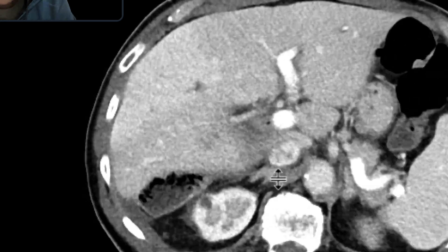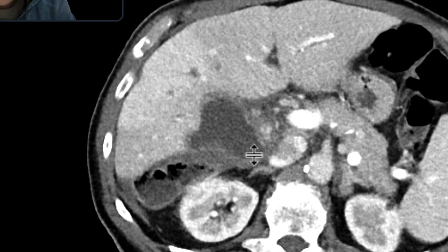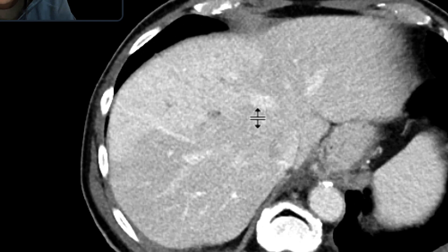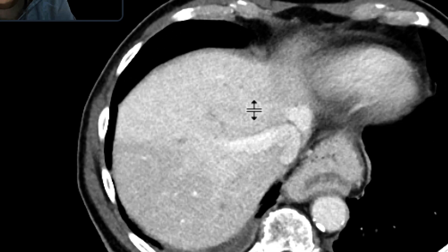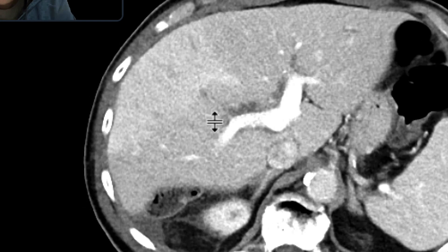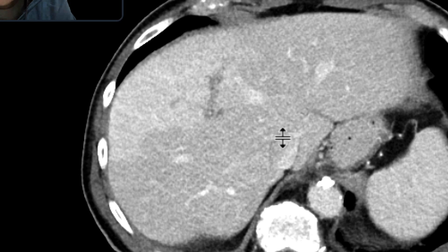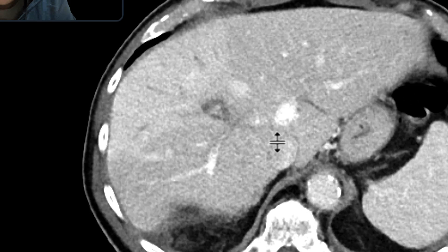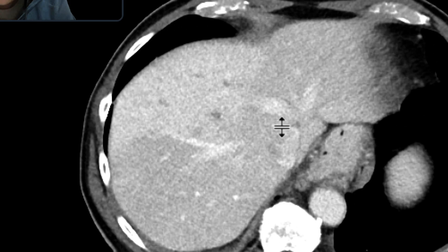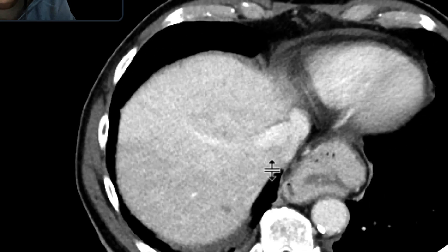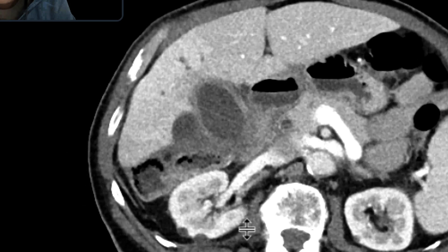The liver parenchyma itself looks quite hyperemic. Looking at the vessels in the liver, the anterior branch of the right portal vein is diminutive, and as it goes out more distally there are some filling defects.